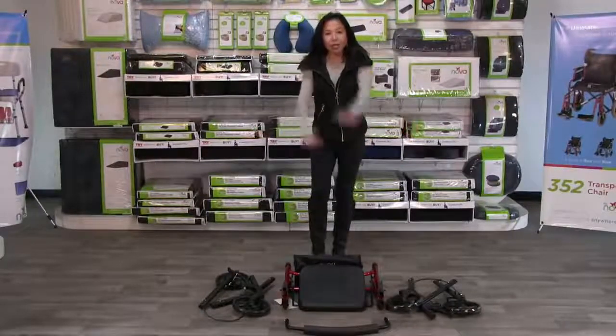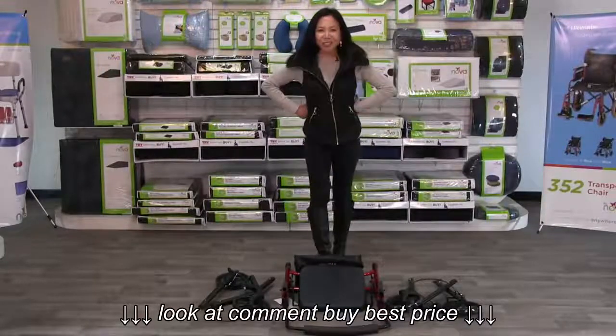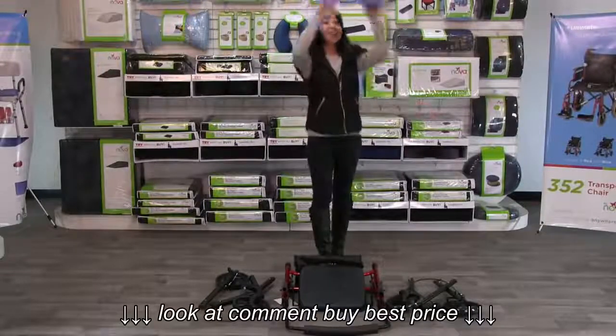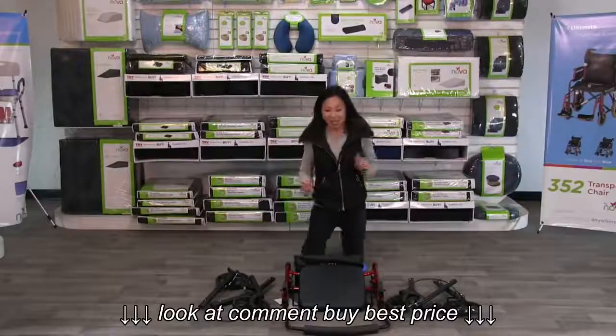Taking it all out of the box is actually a perfect time to use the BackJoy kneeler cushion to support your knees.